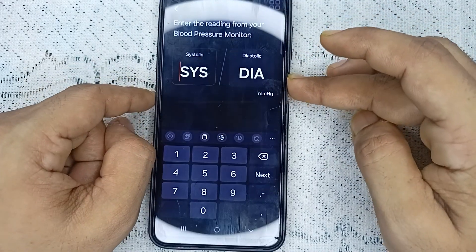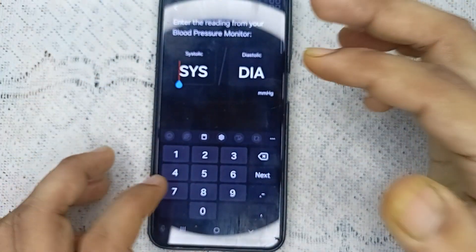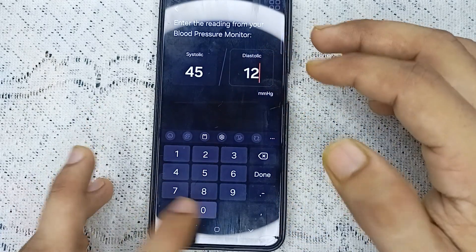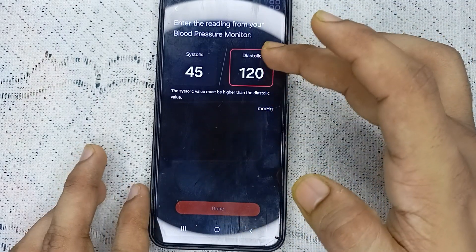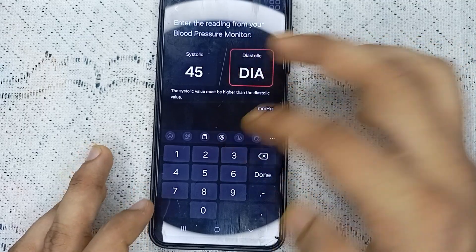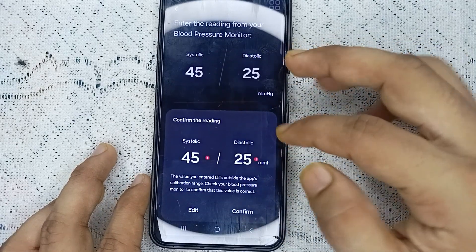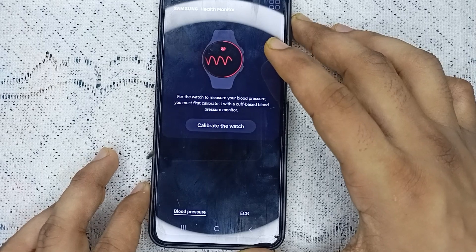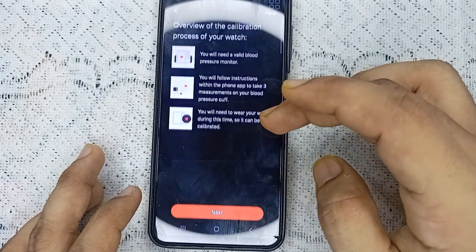Here you can enter the details from your blood pressure monitoring machine. In this demo, dummy data is being entered. Once you have typed in your values, click 'Done' and then 'Confirm' to complete the calibration.